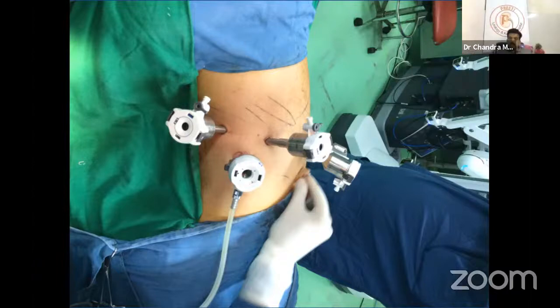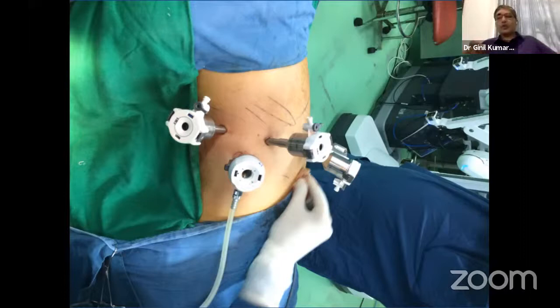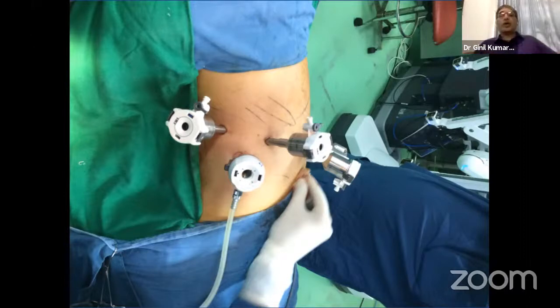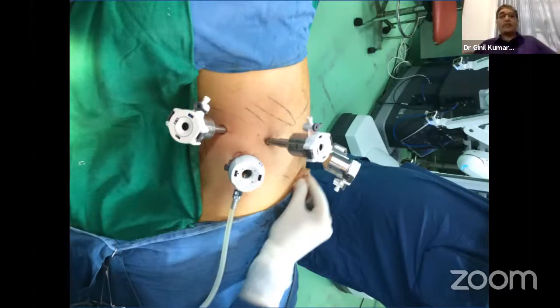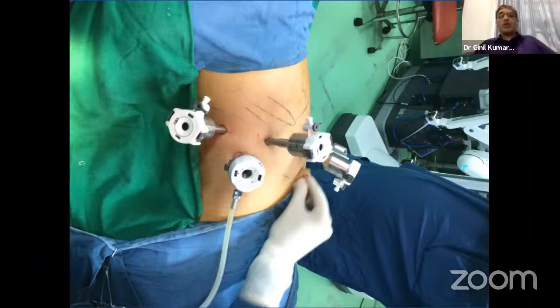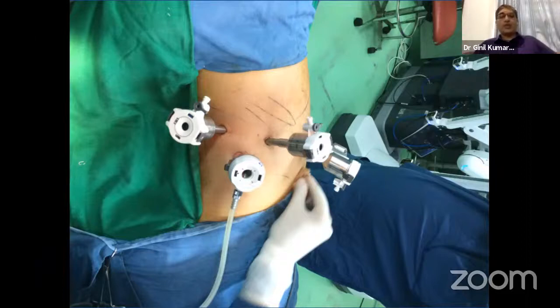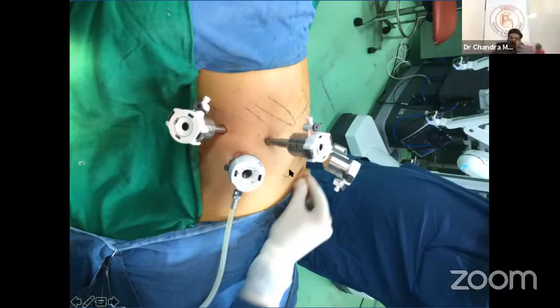We put a port like how we used to and introduced the robotic port through the port — like a port-in-port technique. Four robotic ports are used. One is for camera, two are for instruments, and one can be used for retraction, though sometimes we don't use the third port.